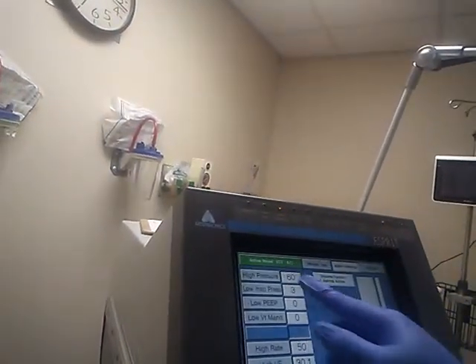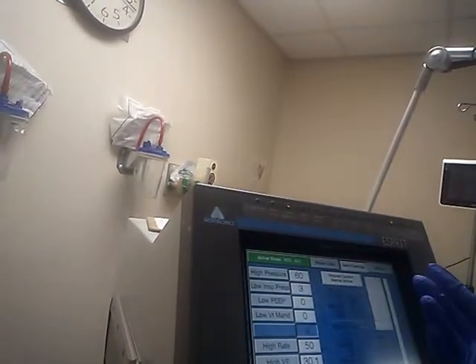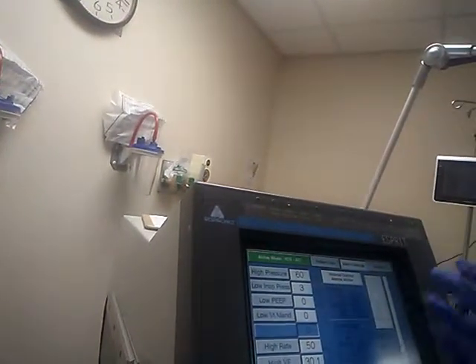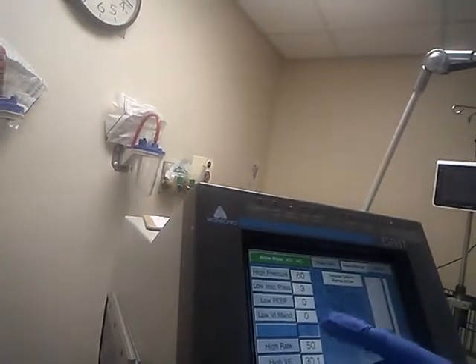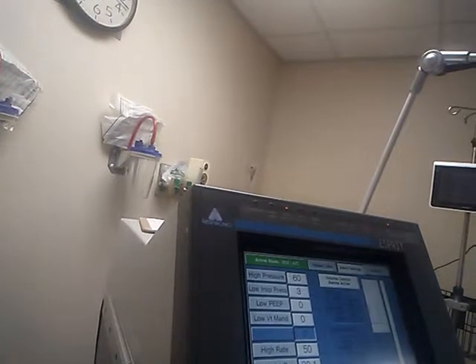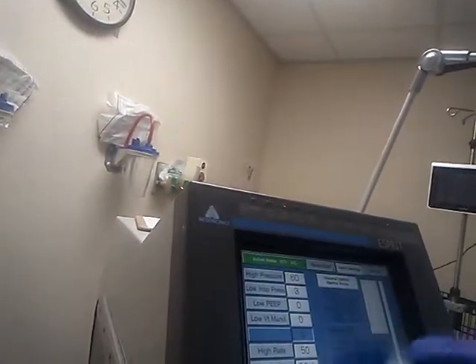Our alarms, we're going to keep our high pressure alarm at 60, a low PEEP at 0. Low inspiratory pressure, we have that at 3, which is fine. And low mandatory tidal volume at 0. High rate at 50, low minute ventilation 3.0, and apnea of 25. We really can go down to 20.